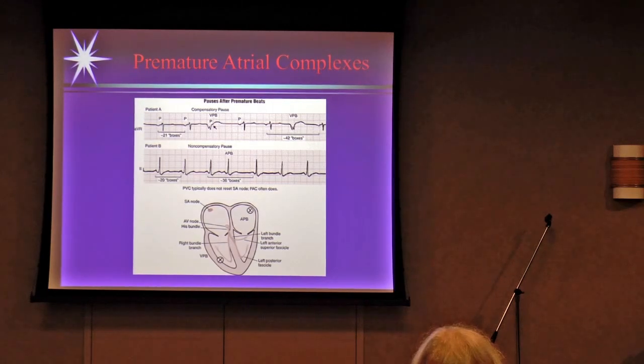Now all it's saying to you is that the person's getting older, and the SA node's getting a little tired, the atrium's getting a little irritable, and every so often the inside of the atrium fires. There's no real clinical significance of a PAC.